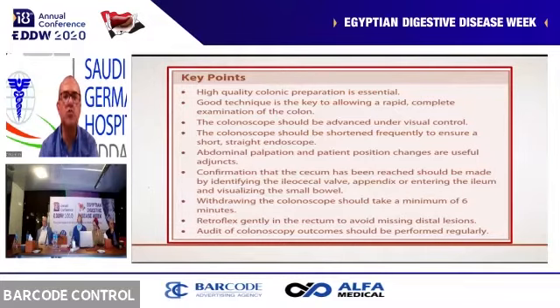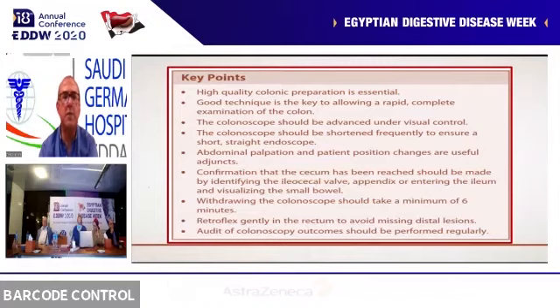Withdrawing the scope should take a minimum of 6 minutes. Retroflex gently in the rectum to avoid missing distal lesions. Lastly, audit of colonoscopy outcomes should be performed regularly.